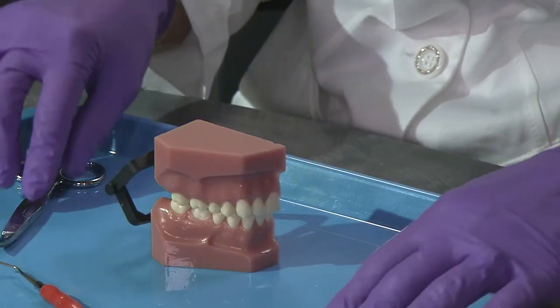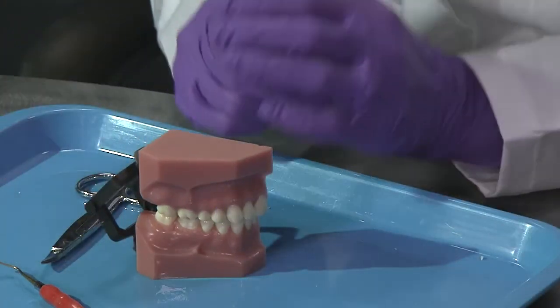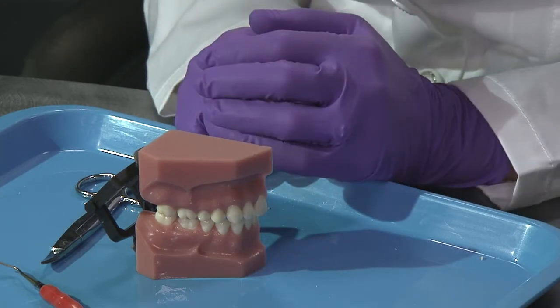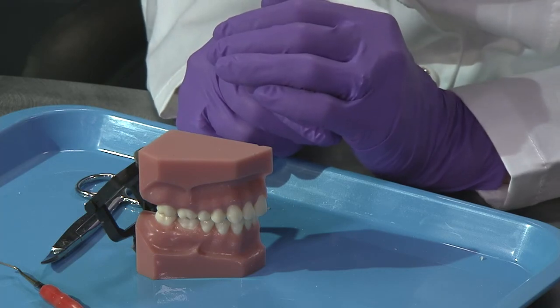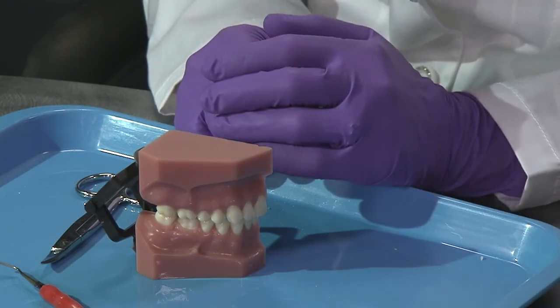We don't have to worry about having all those extra steps. The doctor can anesthetize the patient and we can get moving. When we're done, all it takes is just one little restoration — molars, premolars, and canines. Just choose whether you want small or large, and 90% of the ones we're using are the small. I hope this will be a great added tip for you to actually fabricate something so quickly — within three to four minutes. But you're going to have to make a few. I usually say when you get to that third one, you'll be a pro, and you'll be able to fabricate these in minutes.